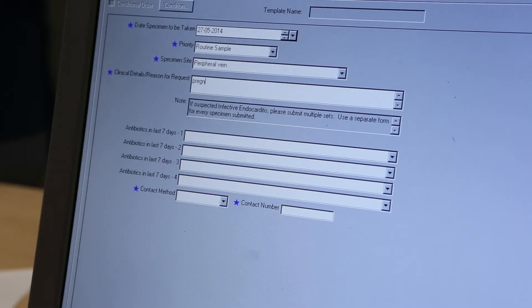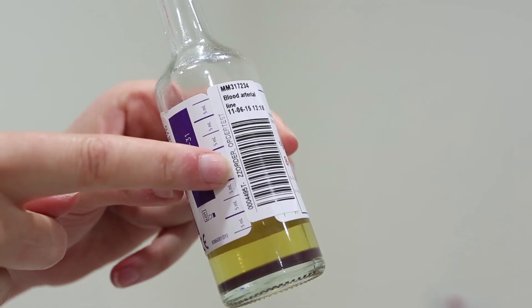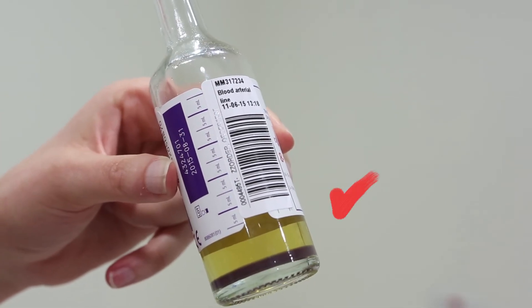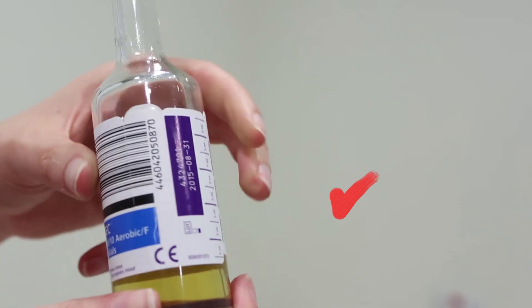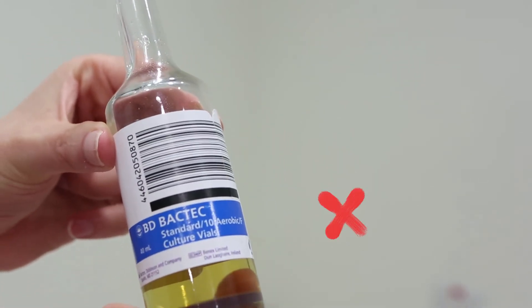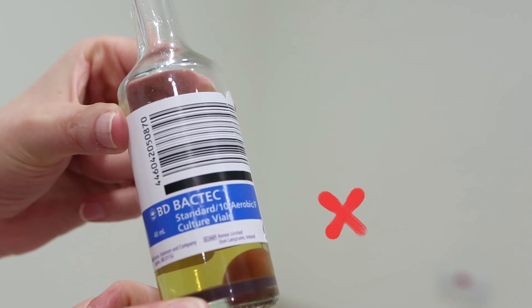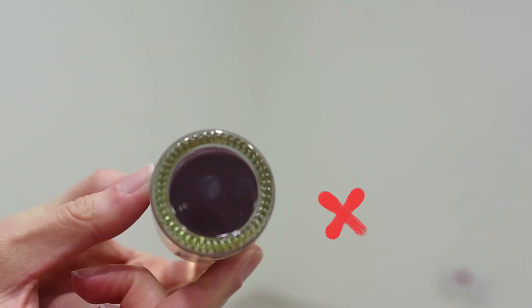Comorbidities, the presence of prosthetic implants, immunosuppression and antimicrobial therapy as these may affect the processing of the specimen in the lab. When labeling the specimen do not cover the barcode found at the side of the bottle and do not cover the bottle's underside as the sample can't be processed unless both these areas are exposed.